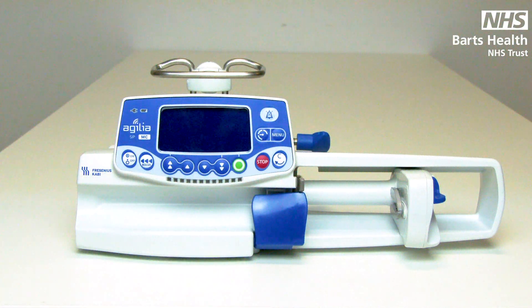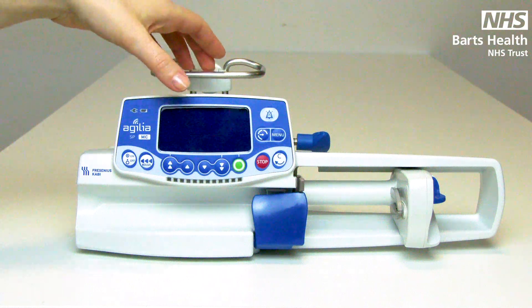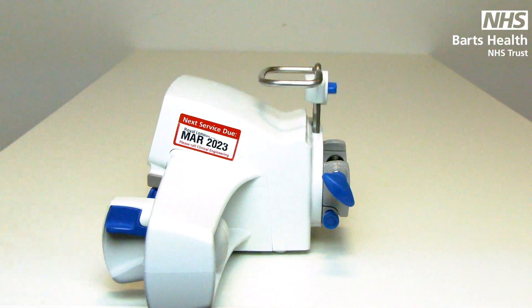Pumps should be used for all infusions five minutes or longer. Regular maintenance is undertaken and the due date will be indicated by a sticker on the side.